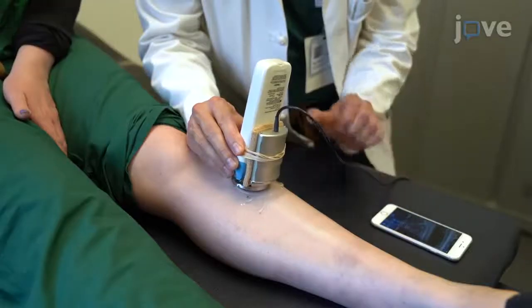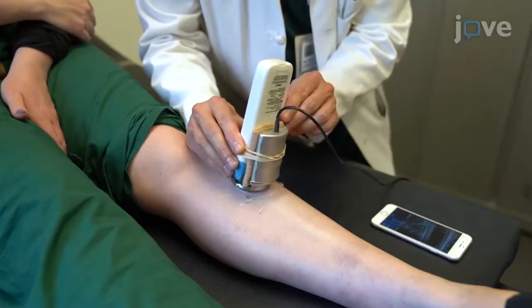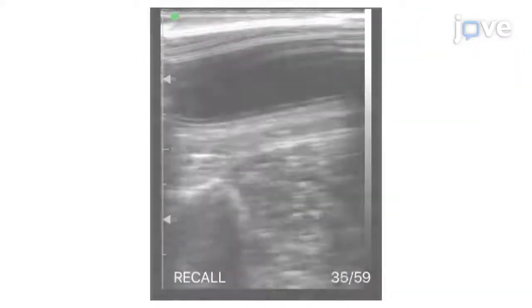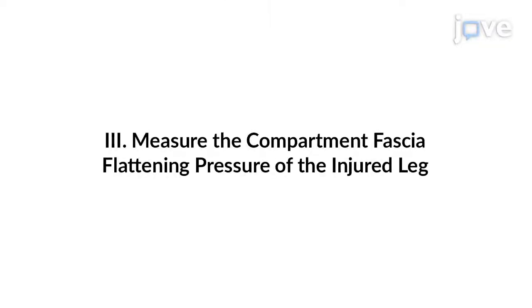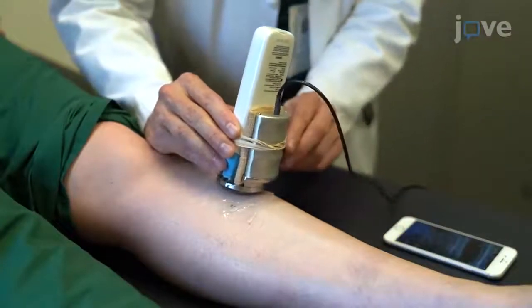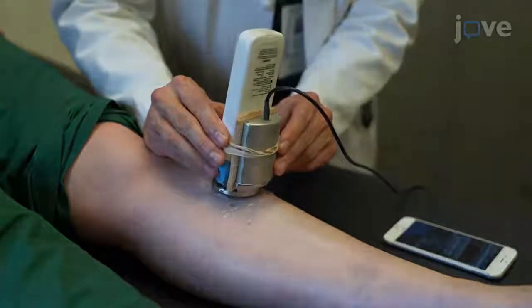Note the geometry of the fascia. With minimal pressure applied, this should be a convex shape. Once the fascia of the anterior compartment is identified, apply slow and steady pressure to the ultrasound probe until the fascia changes shape.